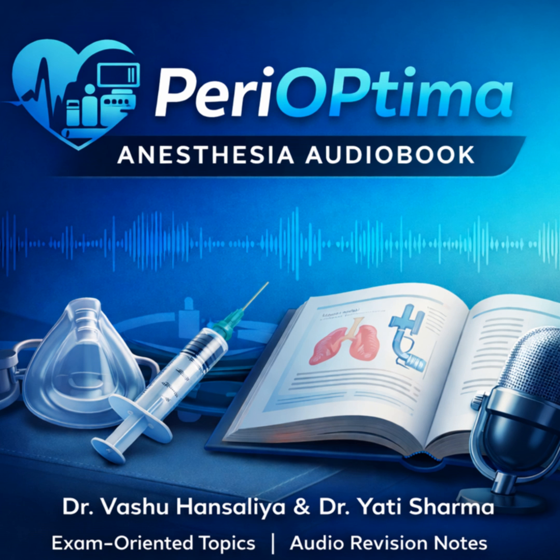If we break down the components, every SGAD is really made of two primary parts. You have the airway tube itself, which ends in that standard 15-millimeter connector we see everywhere in anesthesia. And then you have the hypopharyngeal device, or the mask. This mask is designed to create a seal, directing airflow down towards the glottis and the lungs, while, and this is a critical variable, simultaneously occluding the esophagus. But it does that with varying degrees of effectiveness.